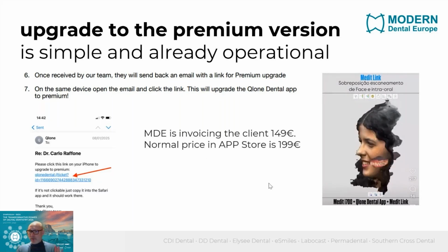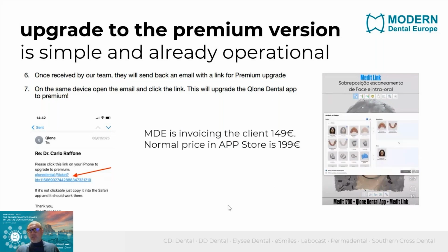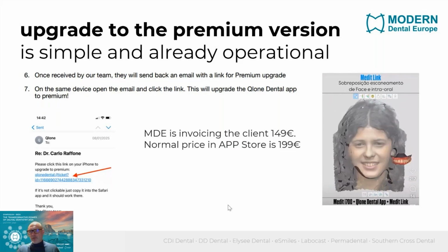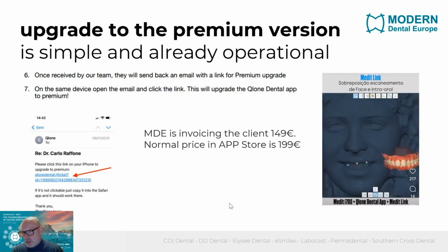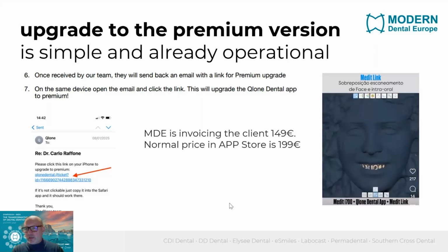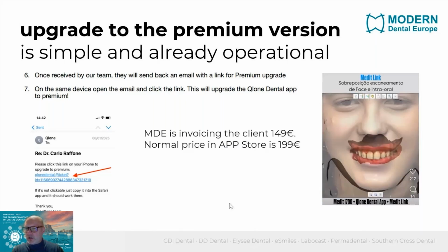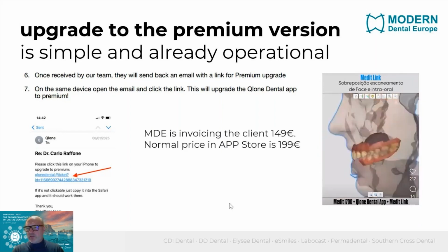Nice app. It's very easy to use, and it gives an incredibly detailed mesh and very high quality of face scan. And of course, we use it, but you can also use it, for instance, in MeditLink. There you can also just in a few steps align the face scan with your intraoral scanners and have this perfect 3D orientation or virtual face bow available.